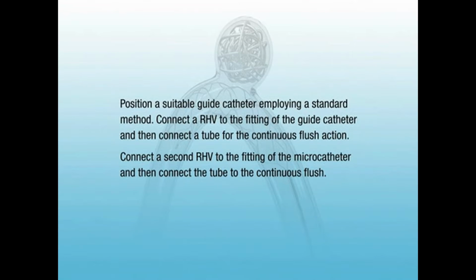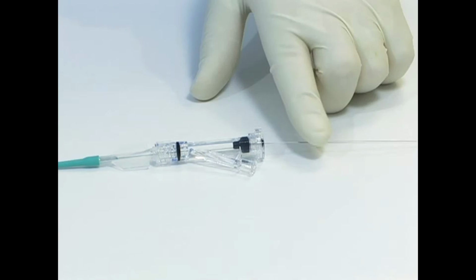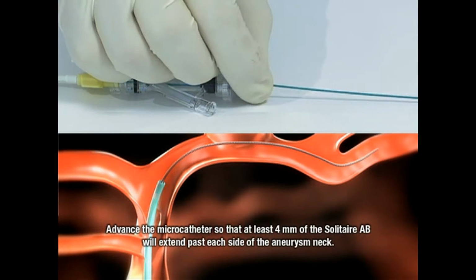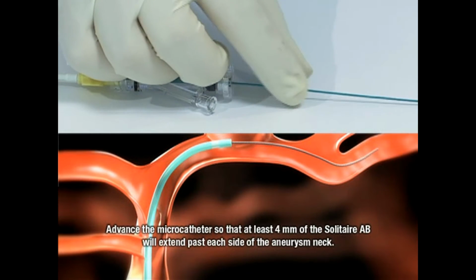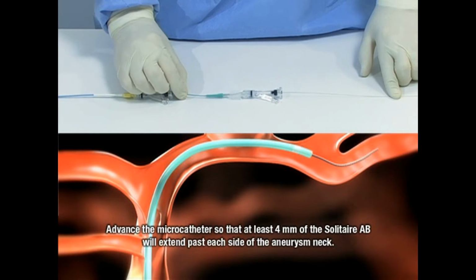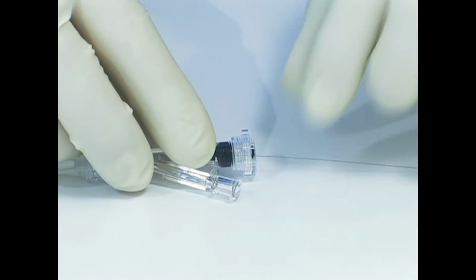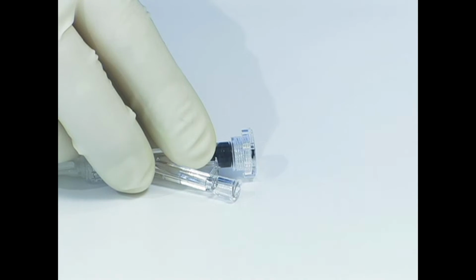Position a suitable guide catheter employing a standard method. Connect an RHV to the fitting of the guide catheter and then connect a tube for the continuous flush action. Connect a second RHV to the fitting of the microcatheter and then connect the tube to the continuous flush. With the aid of a suitable guide wire, hold the guide wire in place and advance the microcatheter until the end of the microcatheter is positioned so that at least 4 mm of the Solitaire AB will extend past each side of the aneurysm neck along the parent vessel when fully deployed. Once the microcatheter is in place, remove the guide wire and tighten the RHV.